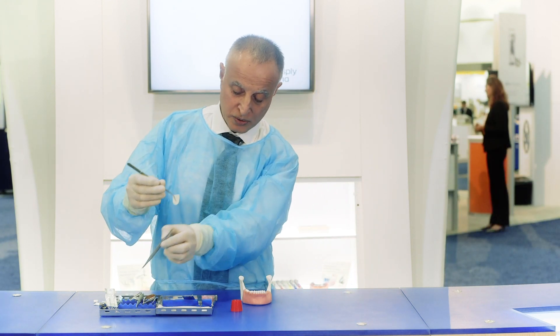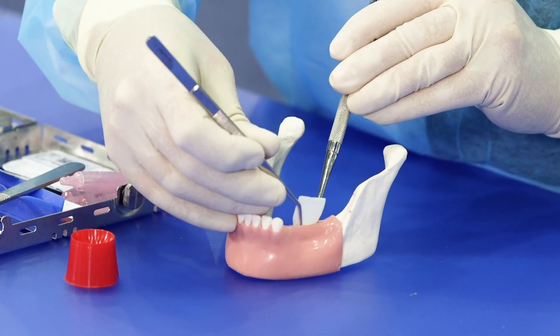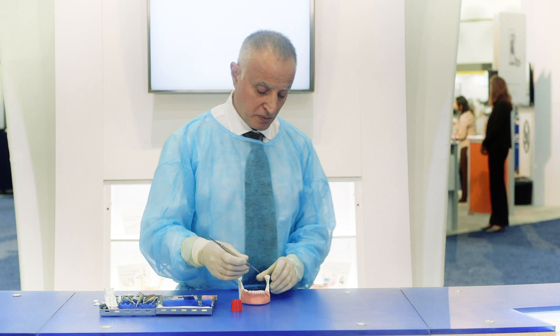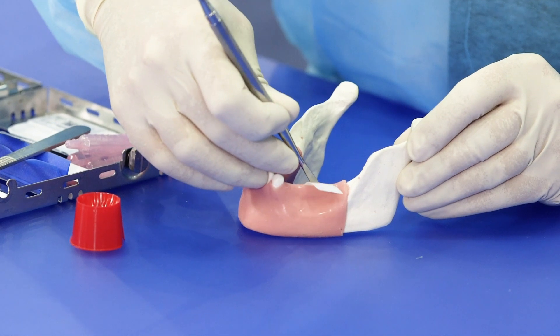We hold the lingual flap and push the OSSIX Plus under the lingual tissue. We secure the membrane under the tissue by pushing it gently with the periosteal elevator.